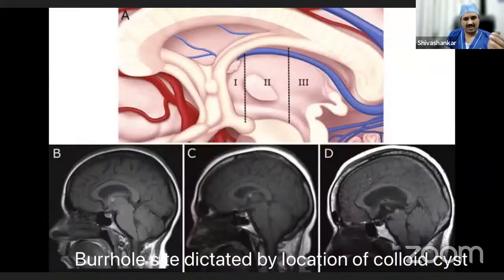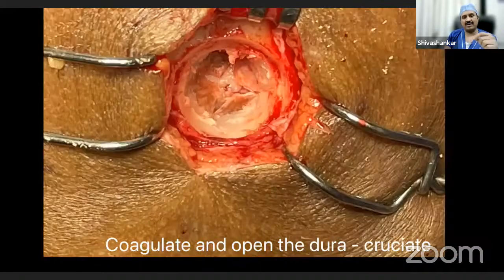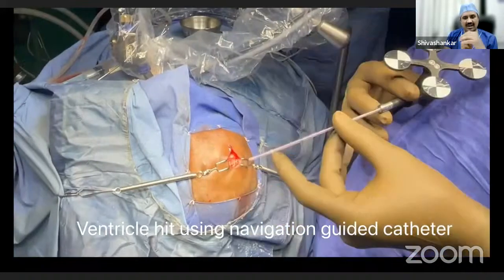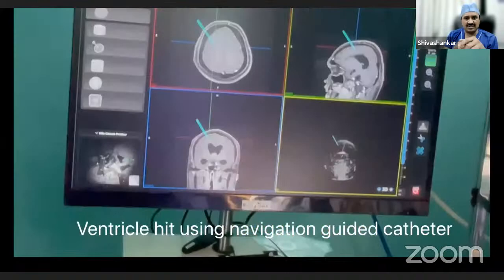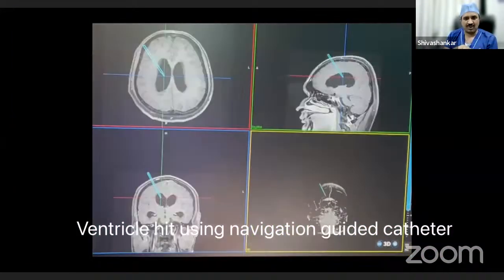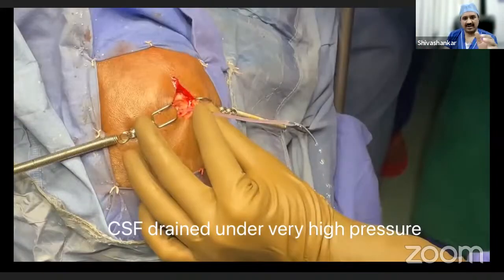We can see the brain is bulging out. It is at high pressure. Then we coagulate the pia, and using this navigation-guided catheter, we hit the ventricle, and it was quite under high pressure. The CSF is drained under high pressure. This is how we entered the ventricle. It can very well be done without navigation also. So this is the high pressure CSF drained in this patient.